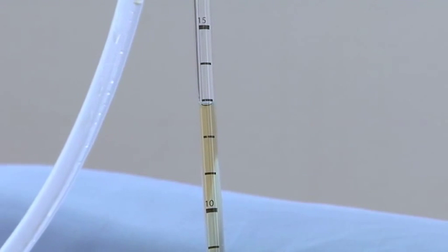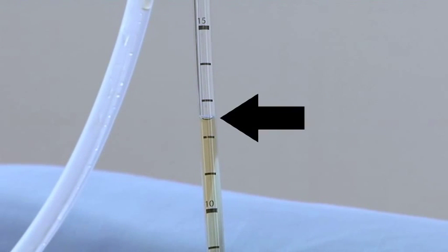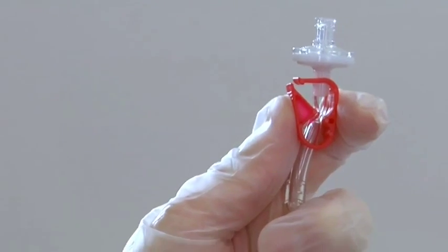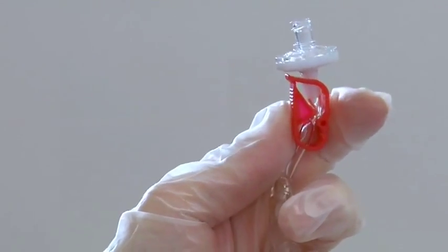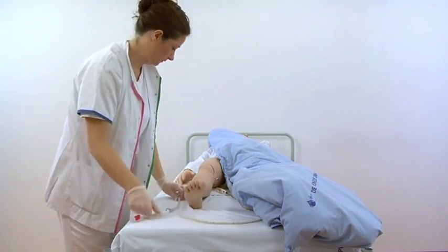Read the urine level at the end expiratory state. Close the red clamp on the unometer abdo pressure and place the tube around the leg of the patient.